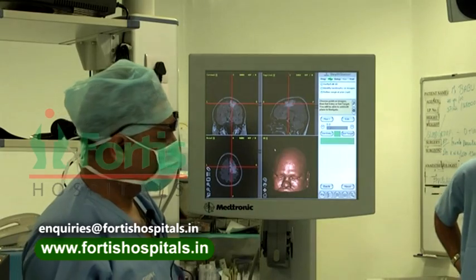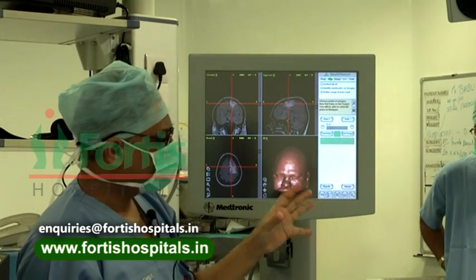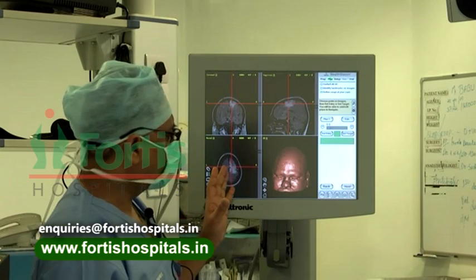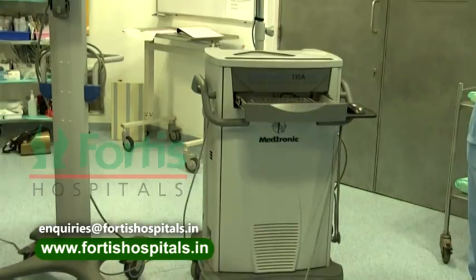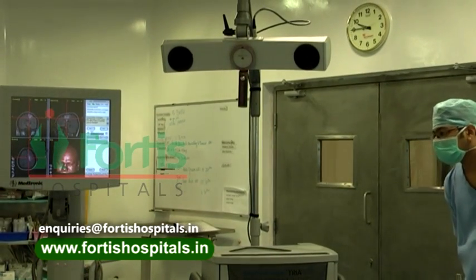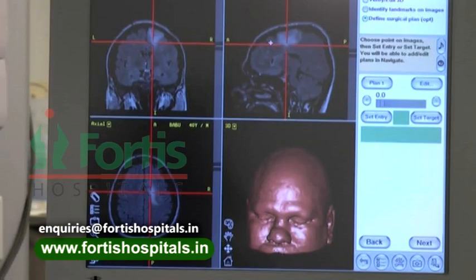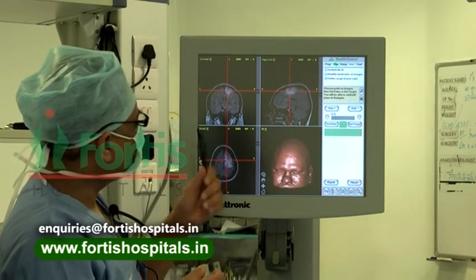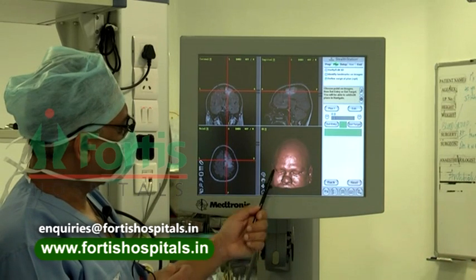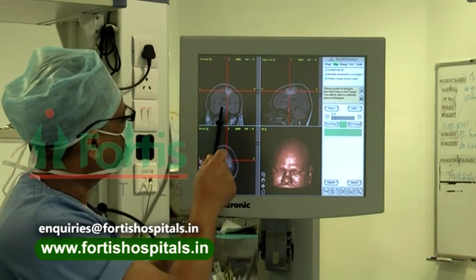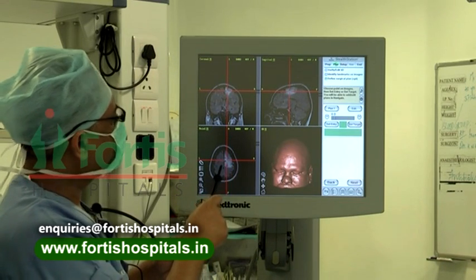This is the intraoperative monitoring station. For navigation we are using the Medtronic Stealth Station. This is the monitor, this is the computer, and this is the camera with infrared light through which tracking is performed. The patient's MRI or CT scan is done with specialized sequences and fed directly to this computer. We then get a reconstruction of the image we want — a total reconstruction of the patient's face, which is essential. We get coronal, axial, and sagittal views.